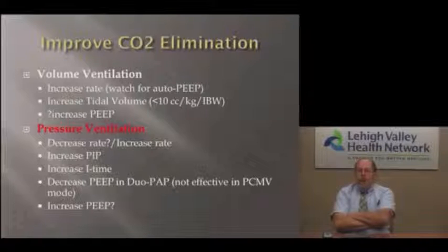Other times it won't. You really have to look at your effect on the plateau pressure. If you increase PEEP and your plateau pressure doesn't increase very high, it doesn't increase or it even comes down, then an increase in PEEP is a good thing. If you add the PEEP and your plateau pressure goes up high, then that's probably causing more air trapping. That's a little tricky with the PEEP, but it can sometimes stent airways in patients that have airways disease.